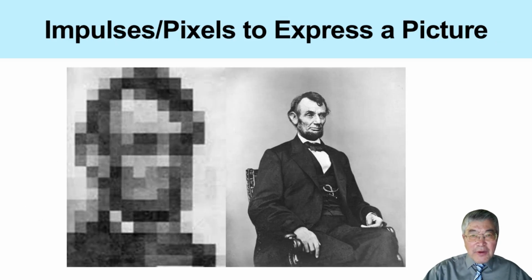If we view an image as a collection of pixels, or in 3 dimensions as a collection of voxels, then we are using the particle point of view. Here, the image is represented by many small localized elements. Each pixel has an intensity value, and together these pixels form the full picture. For example, on the left, we see a low-resolution pixelated image. Each square block represents one local image element. On the right, we see the original continuous-looking picture.